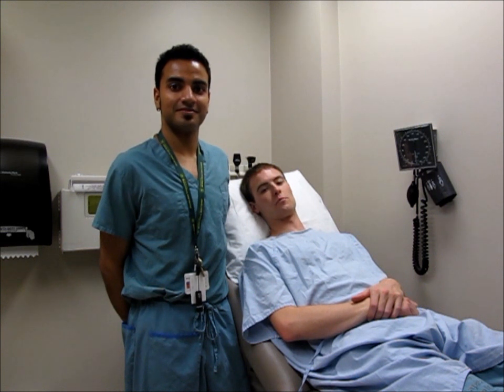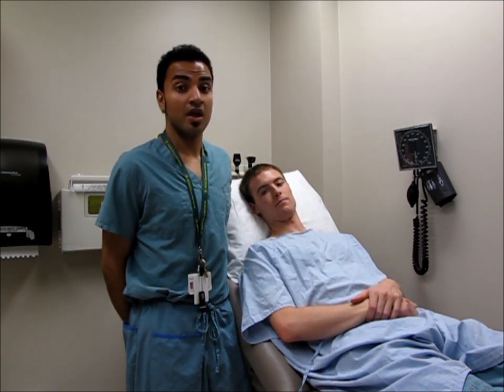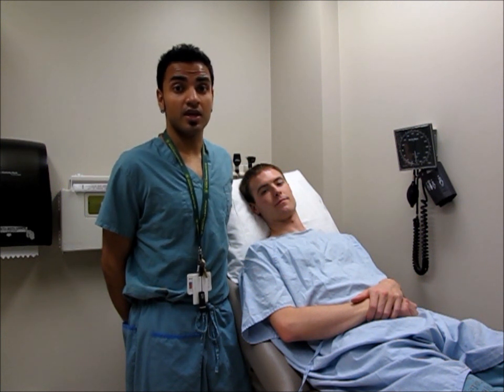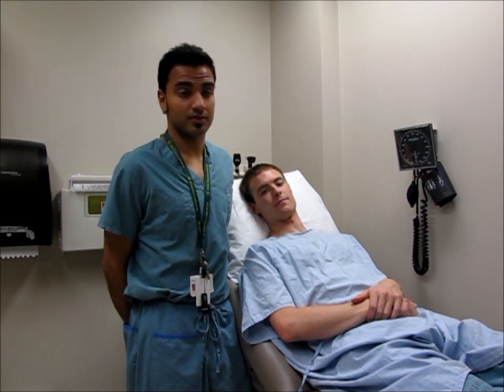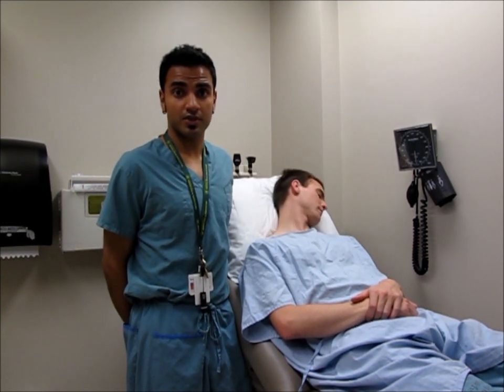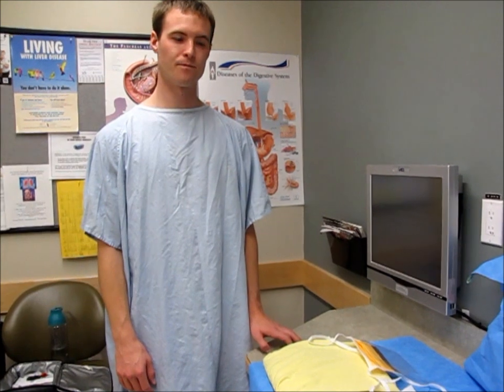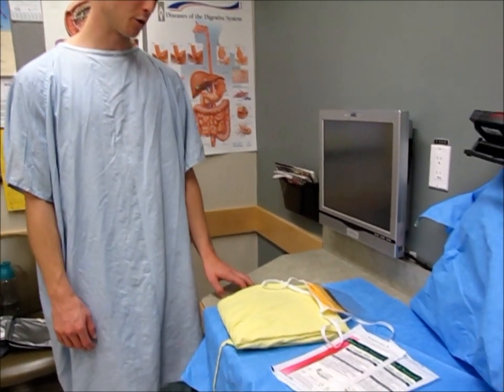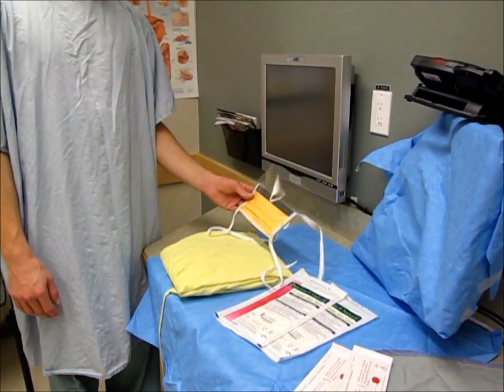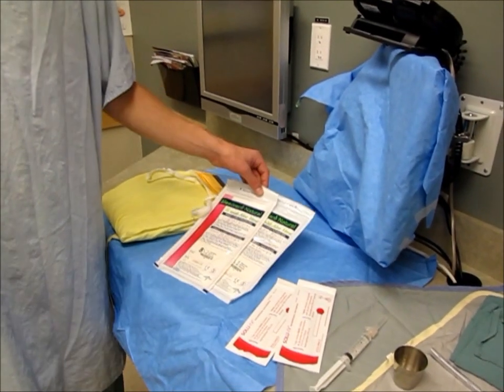As with any operative procedure, preparation is the first and most important step. The first step of preparation is obtaining consent when possible. In the event of a trauma with an unconscious patient, consent may not be able to be given. In general, the first item you will need is proper barrier equipment, including face mask with shield, gown, and sterile gloves.